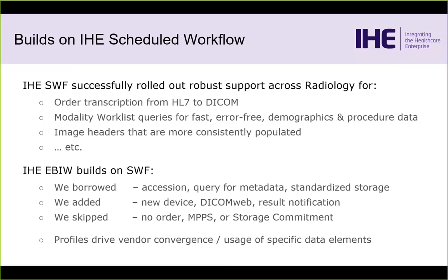So in addition to things like a point-of-care ultrasound system, which frequently is an ultrasound system that you would also use for order-based acquisitions, we also added a lightweight device, which would cover things like tablets and cameras and smartphones. And we added the use of DICOM Web, which is a set of parallel technologies to the conventional DICOM that's a little lighter weight to implement, a little easier for newer programmers to deal with. And then finally, result notification, which we'll see in a few minutes.